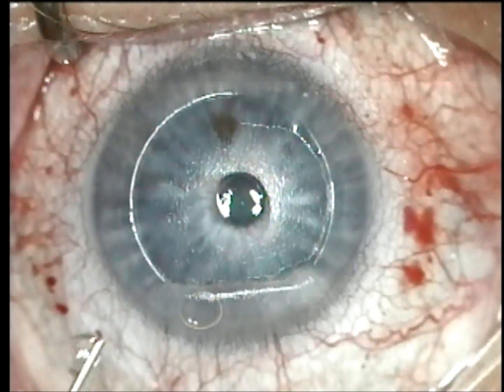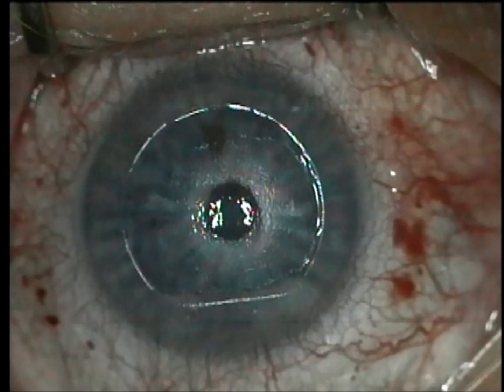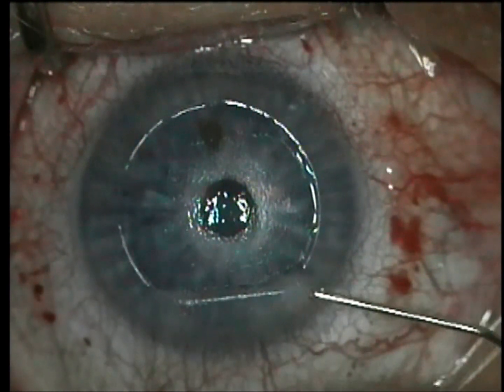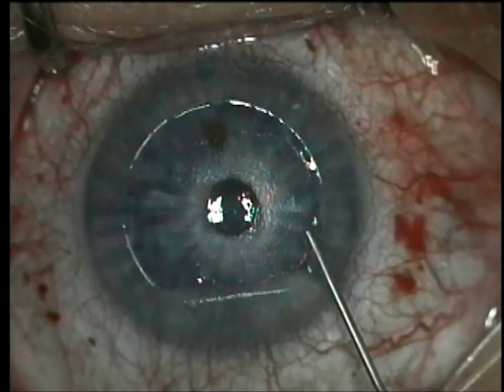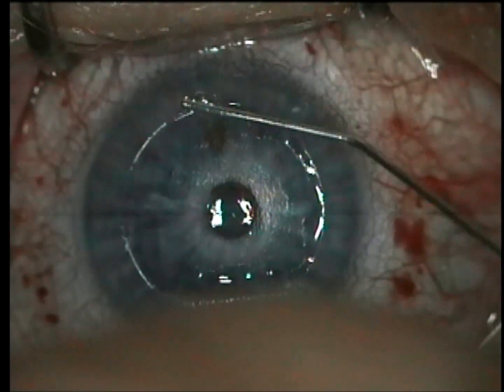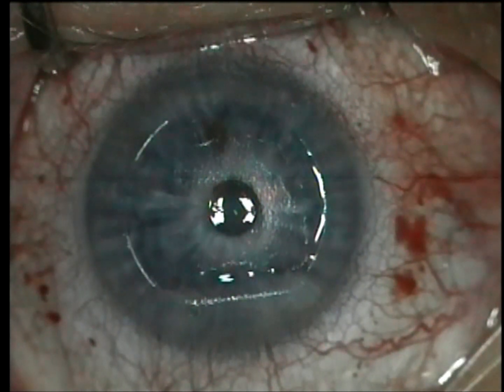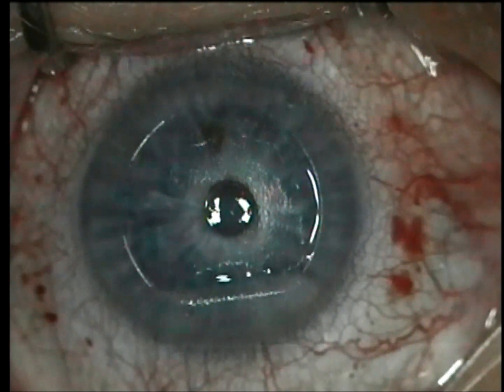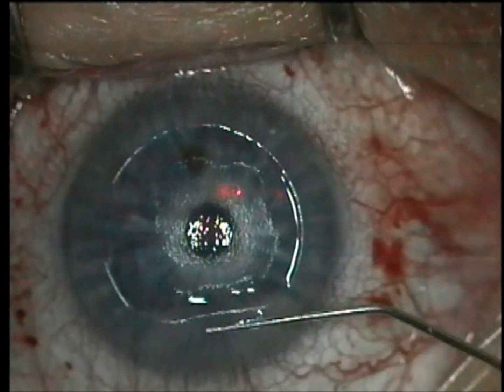I'm wetting the underside and top side of the flap. I also use that 25 gauge cannula to put a little BSS on the edges of the cut stromal side of the cornea as well. I feel that keeping all these surfaces moist is important because this procedure takes longer than a typical LASIK and you're using less fluid generally — this cuts down on getting stria and debris in the flap. So the edges I keep moist with BSS, the stromal side of the flap I keep wet, and even the epithelial side I'll squirt under there. All this is very important.